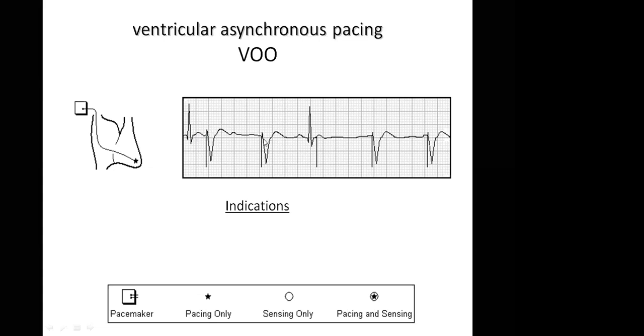And you continue to pace the ventricle. But the next thing you also emphasized is this: look at this intrinsic activity, and it's still paced almost on the intrinsic activity. Although you did not say a QRS, it simply means that it was in the absolute refractory period. That's why you did not say a QRS. If you pace a ventricle in its refractory period, it will not generate a depolarization. Exactly. So that was what happened.